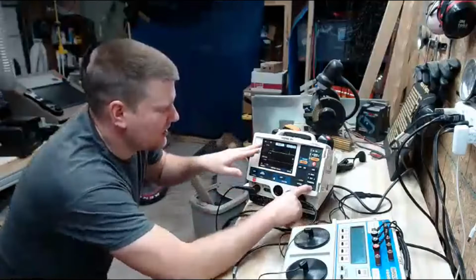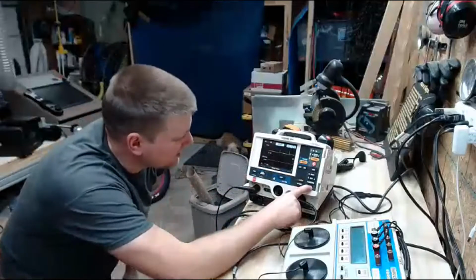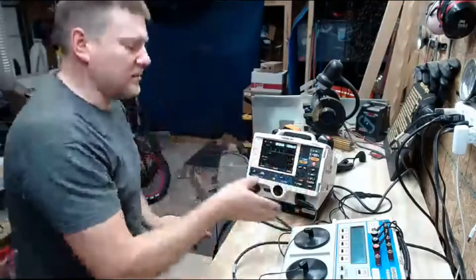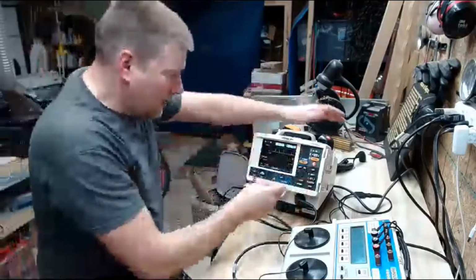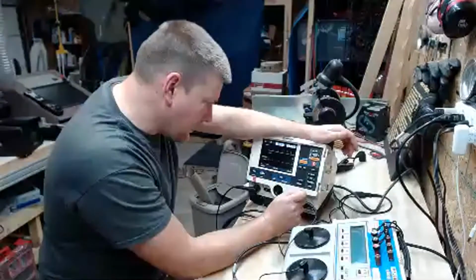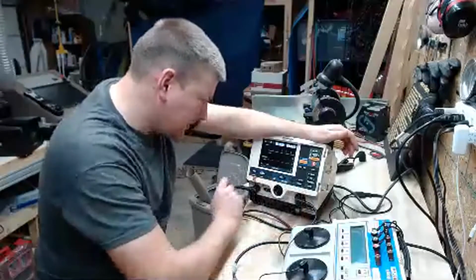And that's all the doctor's going to do. He wants to see the heart rate, so he's going to hold the button, look and see what the heart's doing, and then you let go of it, and it goes back to beating the heart for the patient. So that's the pause function. Now let's see. This one is a little different.